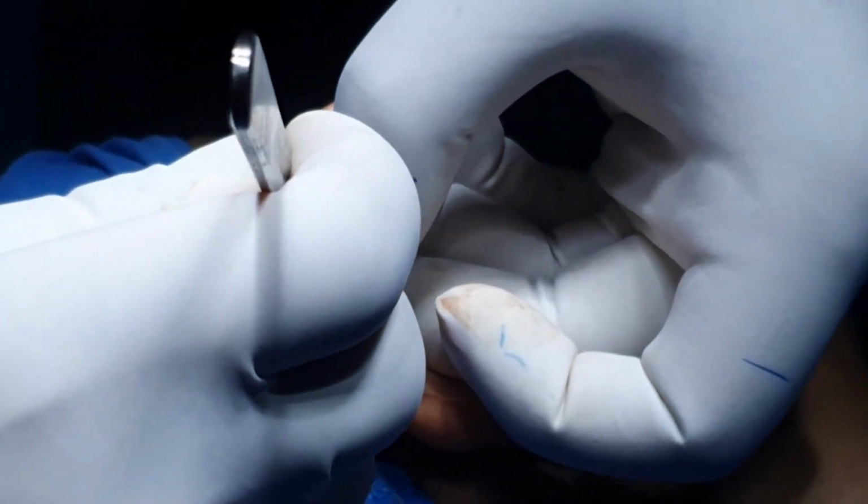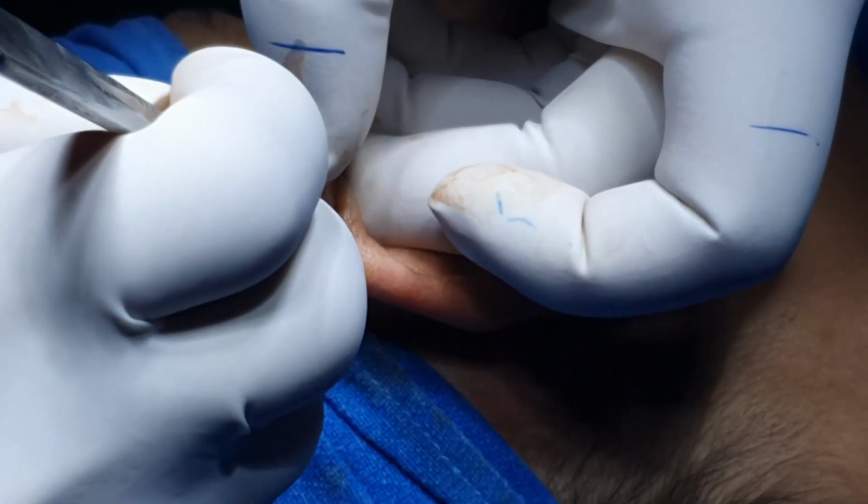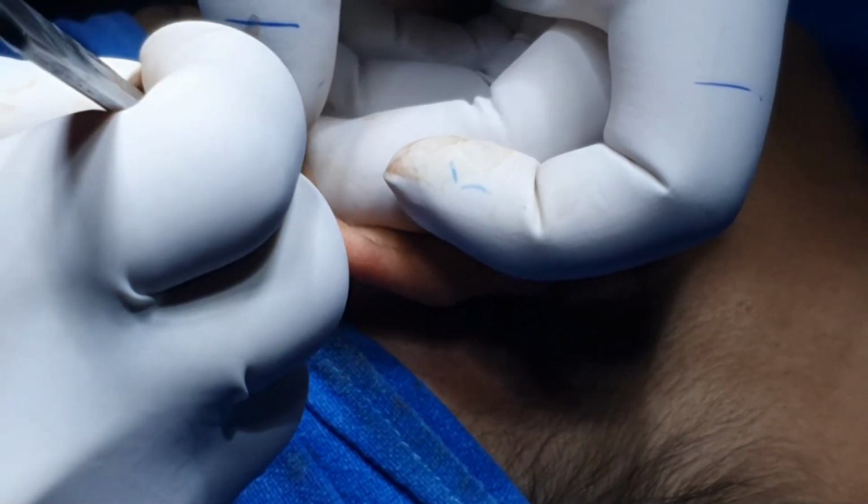So it is relatively bloodless. So try to core out the lesion from here.